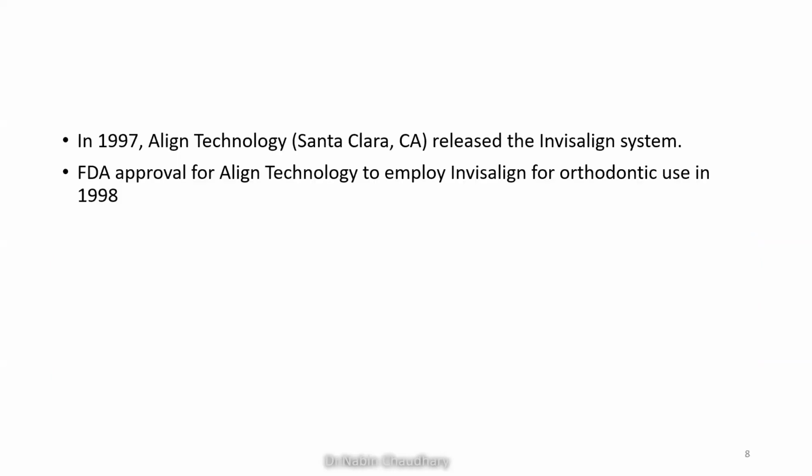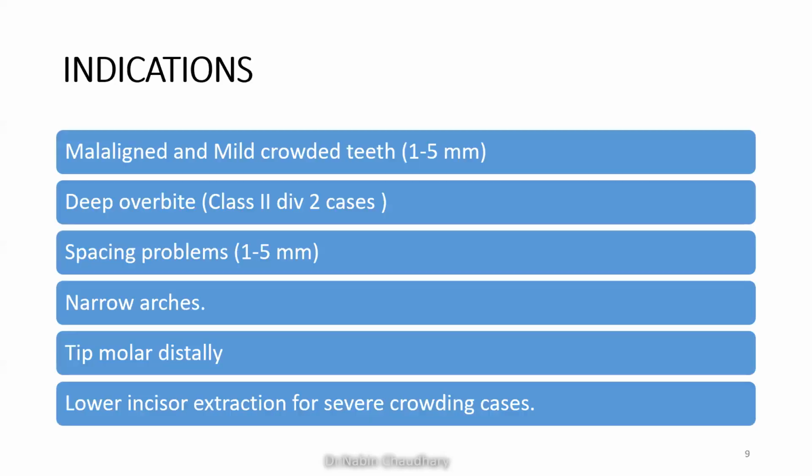So in 1997, Align Technology, Santa Clara, California, released the Invisalign system. However, this Invisalign technology was only approved by the FDA for orthodontic use in 1998.